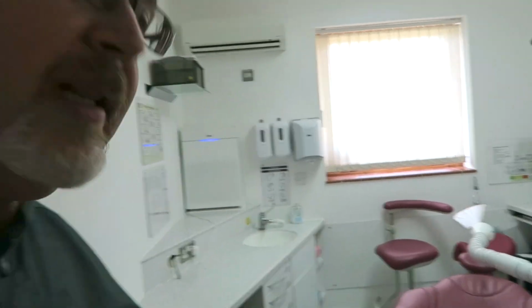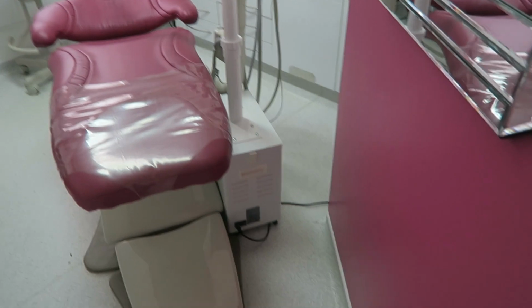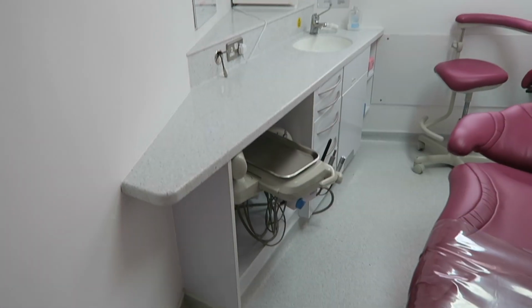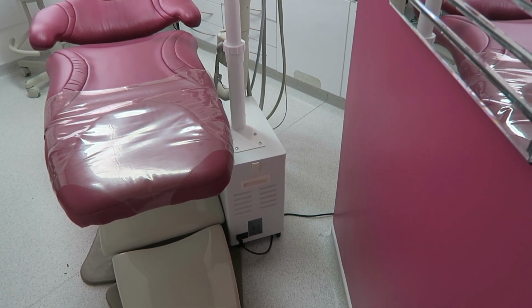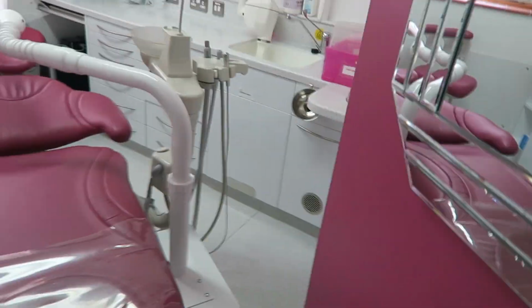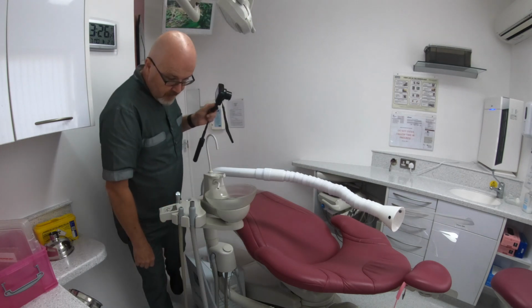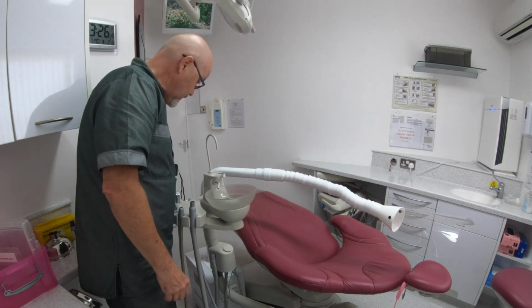If anything is going to be a challenge in terms of positioning a DentalAir or a VacStation for that matter, both units are roughly the same size in terms of the base unit. It'll be this room. We've got sort of a narrow walkway here with the chair, and then the delivery unit to the side there. I was very worried about the unit being down here, that it would prevent the walkway through for the nurse, but I can come on through here, and even I can actually get through there quite easily. So that's actually pretty good.